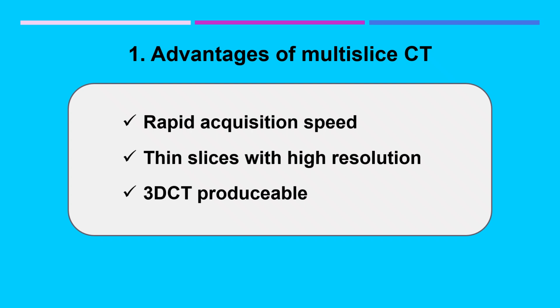Multi-slice CT has several advantages. It allows rapid scanning, thin slices, and high spatial resolution. This minimizes motion artifact and enables detailed assessment of the stomach wall and surrounding structures. It also provides the raw data necessary for 3D reconstruction.